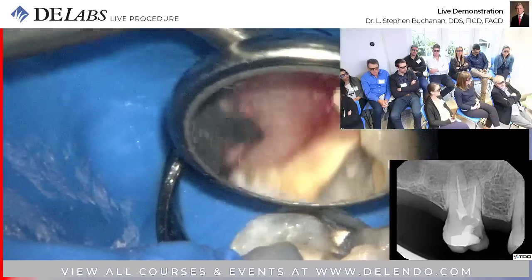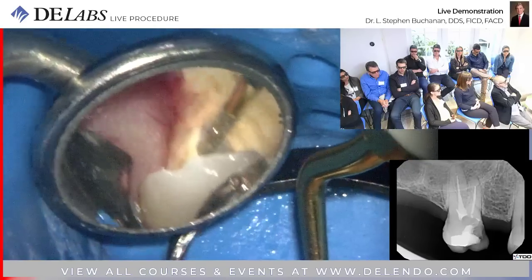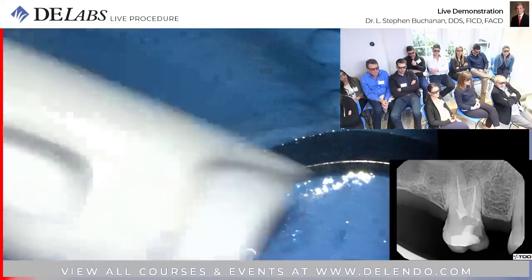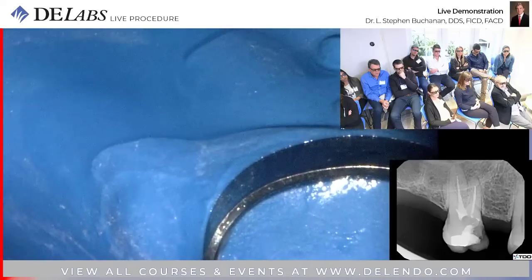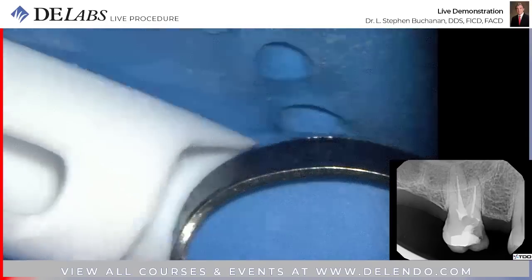There's different ultrasonics out there. Some are a couple $100 for the machine, some are thousands. Is there that much difference? Yeah, there are. Why? First off, the one that we're using, the Acteon, yes, thank you. The Acteon, they don't break. They're super robust, but also they self-tune. So at lower settings, they'll find the resonant frequency in that range, and so you get more activity from them.